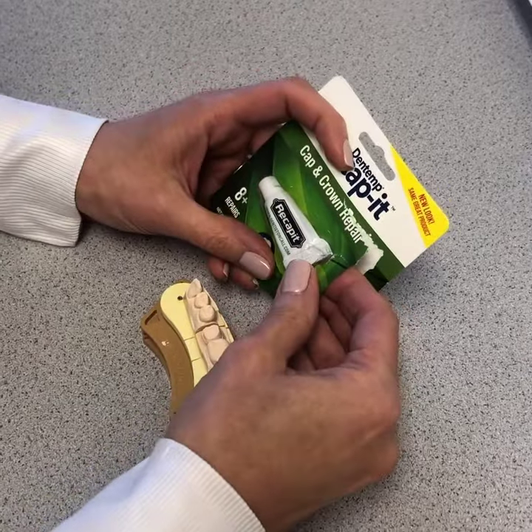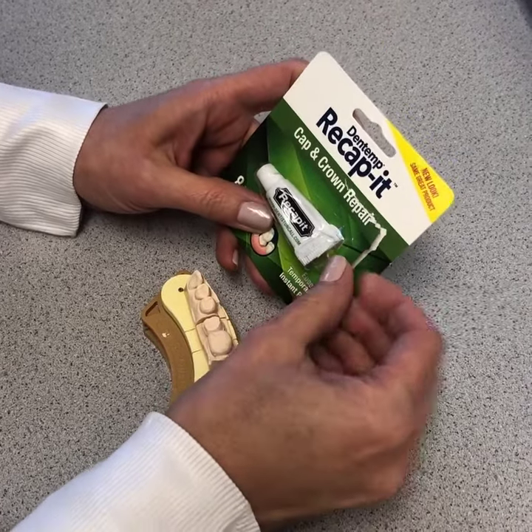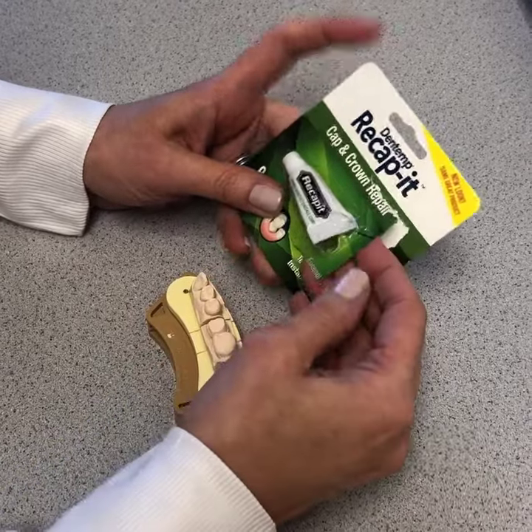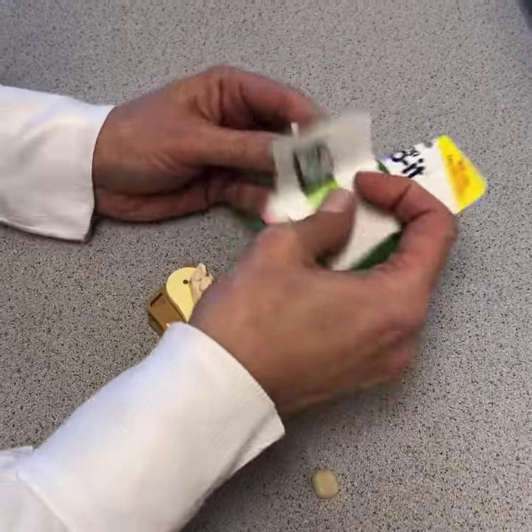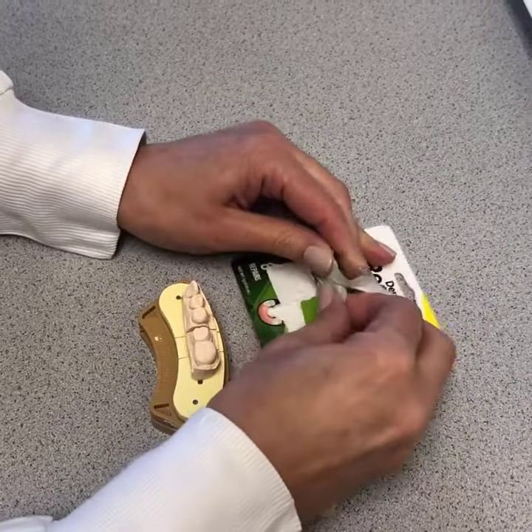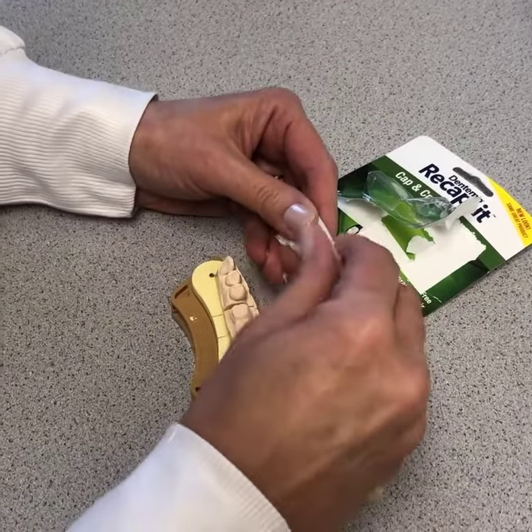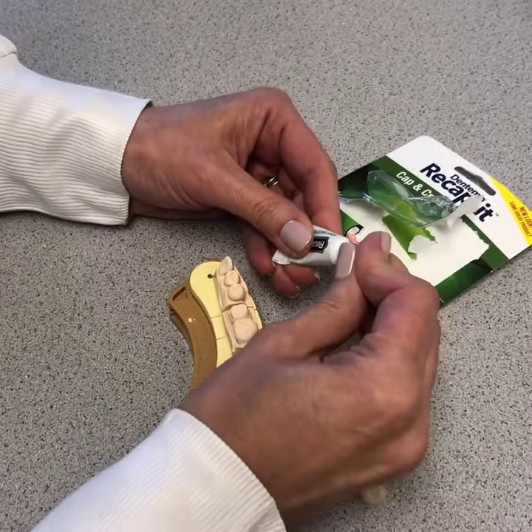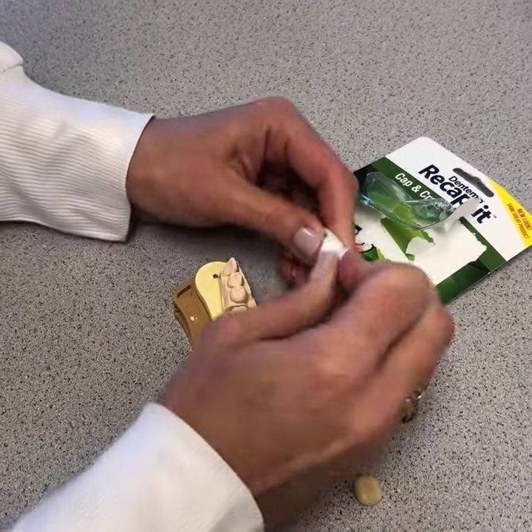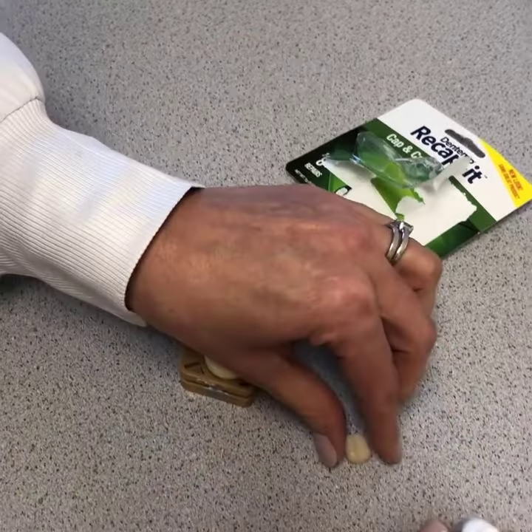This is the cement we chose out of the choices we had in the pharmacy. It says Recapit — for cap and crown repair. We're going to open it up, and it is a little tube. You open it and poke it — it should be like a paste.